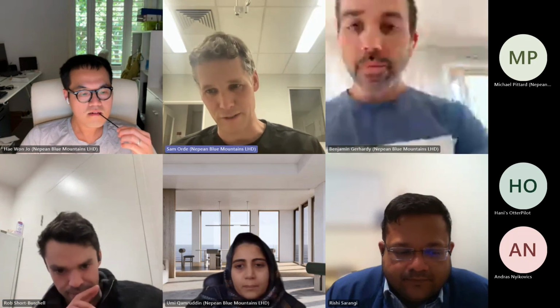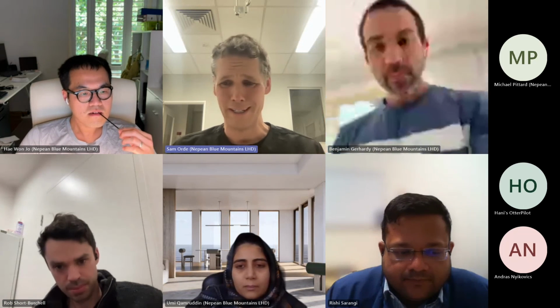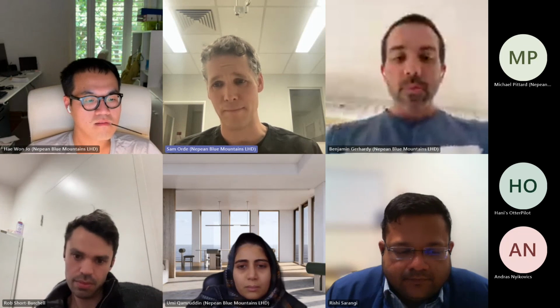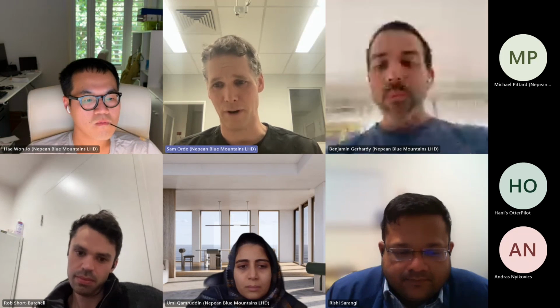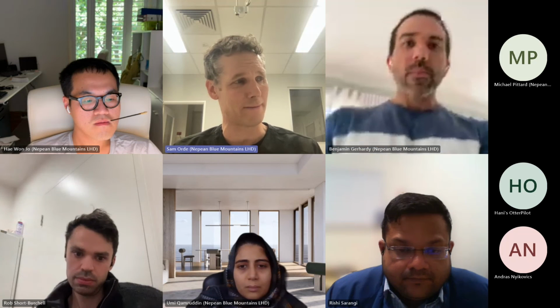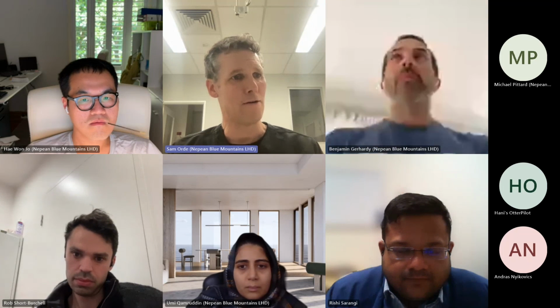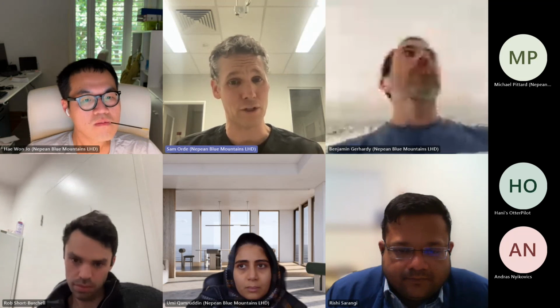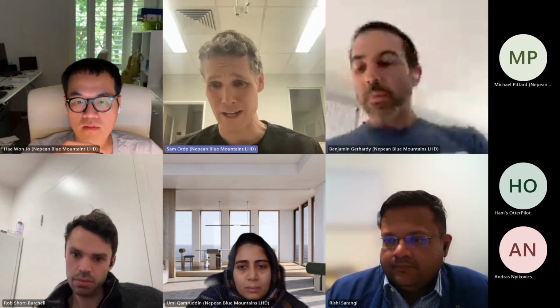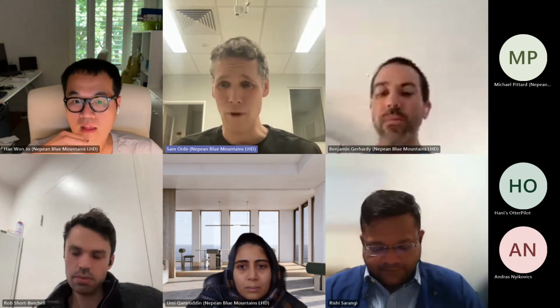I don't do ejection fraction as a standard part of my day-to-day echoes on the unit, because generally I find it takes a bit of time and it's not always changing my assessment. I think it's important for routine follow-up of heart failure patients. So I do it all the time when reporting echoes for outpatients, because we're comparing one thing to another.